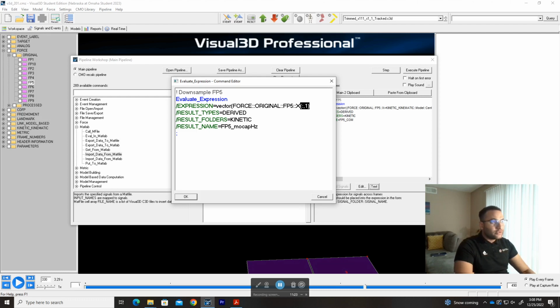Here in Visual 3D you need to type square brackets, and instead of a colon you type -1. -1 means all the frames or columns or rows, whatever you want. Obviously the first section is always the rows and the second section is the columns. So -1, and then we want to use the first column.